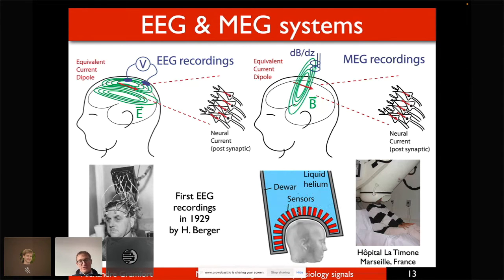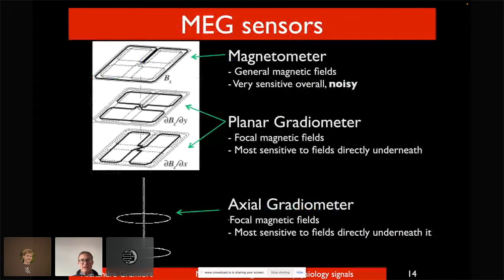All right, so the sensors that you have to measure the MEG are either magnetometers, which measure directly the magnetic field in one position and one orientation. You will get signals in Tesla. Or so-called gradiometers, which can be either planar or axial. So here, a planar gradiometer will measure the difference of magnetic fields along a specific direction, which is here the y direction. Okay, so you measure the field here minus here. You compute the finite difference between the two.